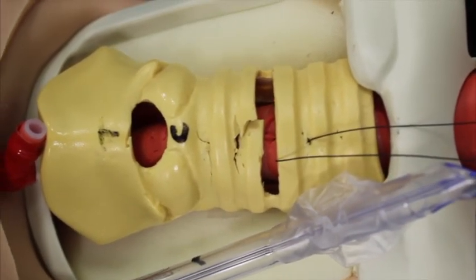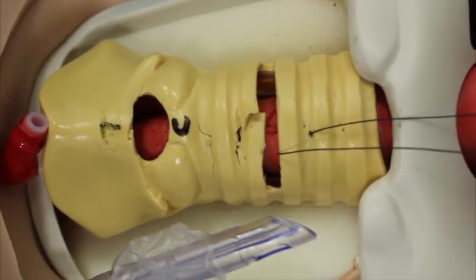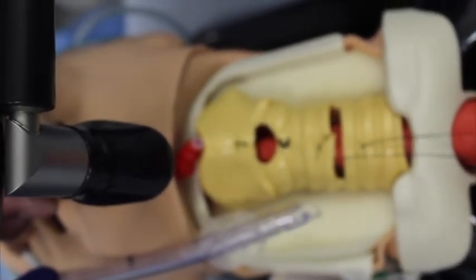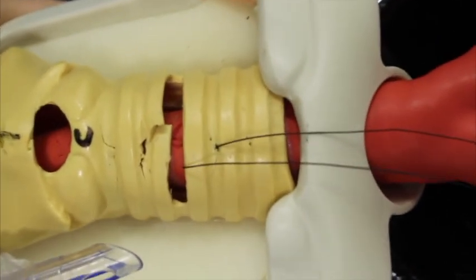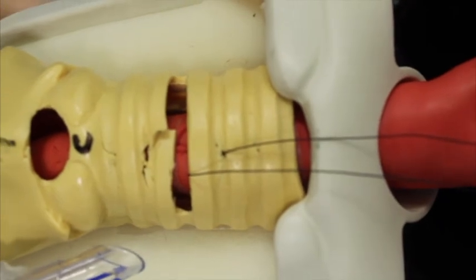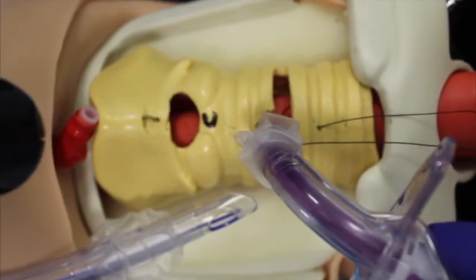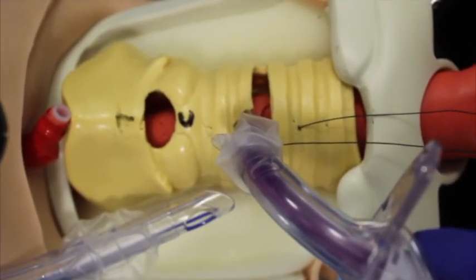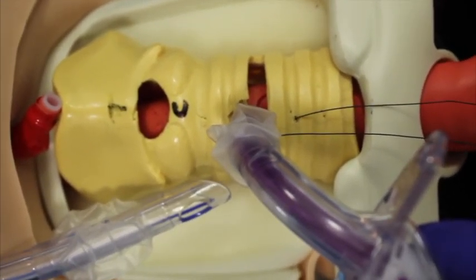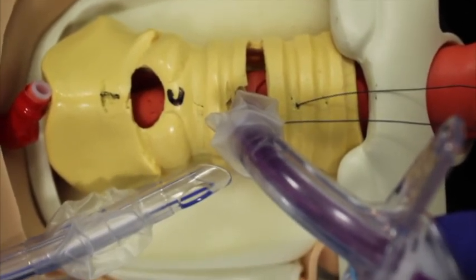The tube can be withdrawn slowly until, under direct vision through the operative site and through video laryngoscopy in the mouth, it is clearly seen that the tip of the oral endotracheal tube lies above the window, at which point the tracheostomy tube can be placed under direct vision by the lead surgeon into the fenestration. The tube is inserted firmly and positioned into the trachea.